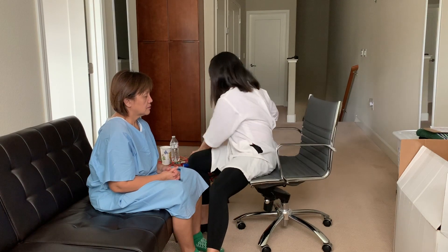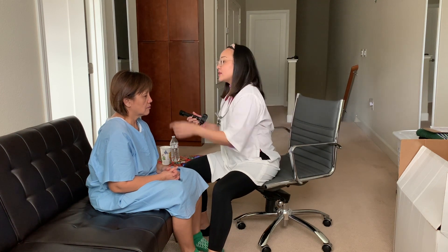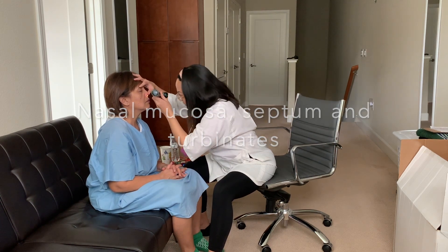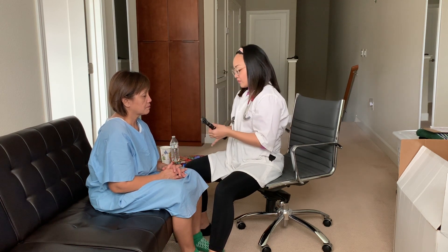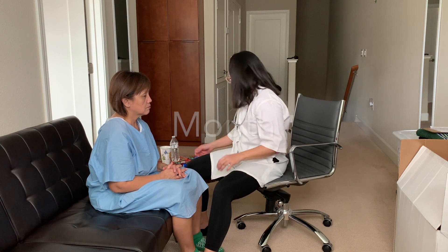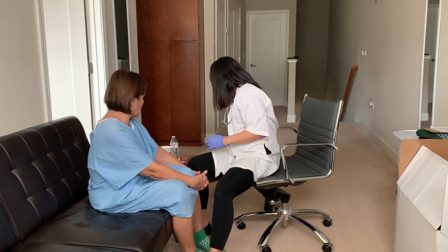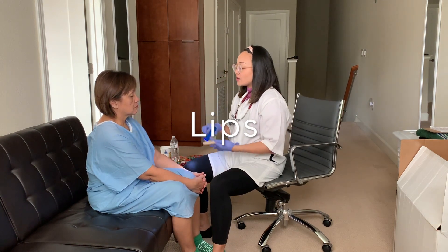So now I can take a look inside. You're going to tilt your head back. I'm going to press the nose to use the nasal speculum. Now I'm going to go ahead and do the mouth. I'm going to wear my gloves. I'm going to look at her lips for any cyanosis.